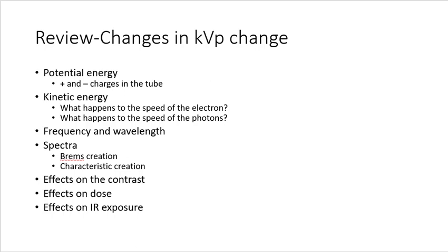Some of your test questions are going to get complicated. I know you find that to be surprising. So pay attention to what the test question is asking you. When you change your kVp, what are the effects on patient dose? What are the effects on image receptor exposure? So you may have a question that asks, as you increase your kVp by 15%, what happens to image receptor exposure, what happens to patient exposure.